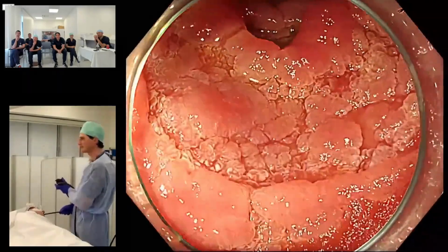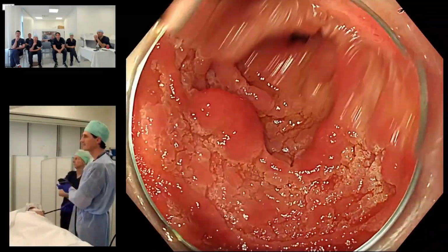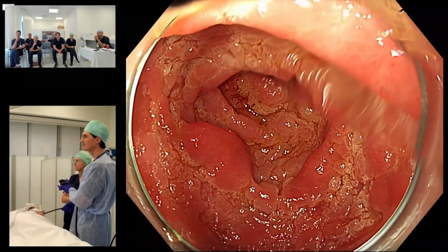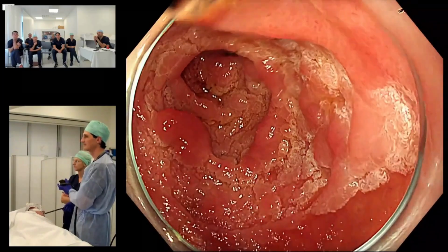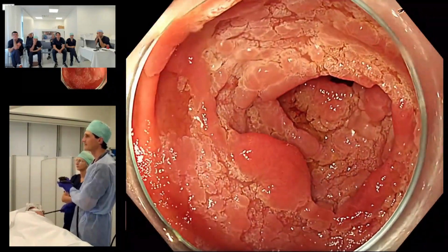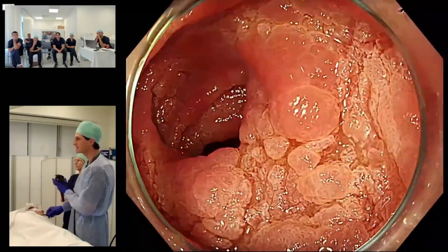I'll insufflate a little bit more. Well, my first impression is that it's not the same at all. It looks extremely different, and I'm extremely concerned about what it might involve. I would say those are the two key differences between this lesion and the other one. And the third key finding for me is it's circumferential. Is this the case? Yes, this is definitely the case. And so, as you can see, it's circumferential over at least a couple of centimeters.